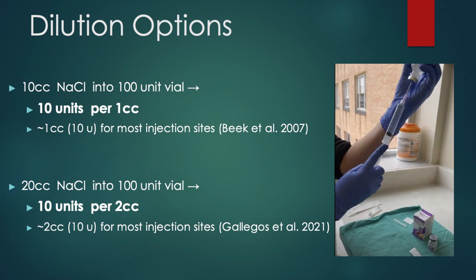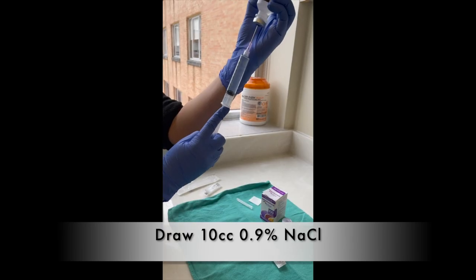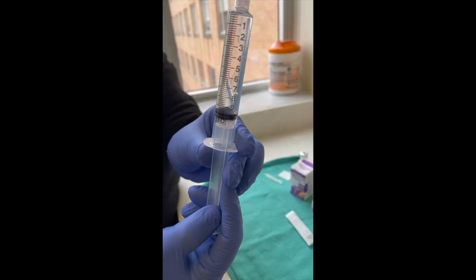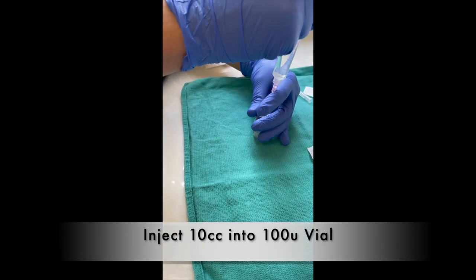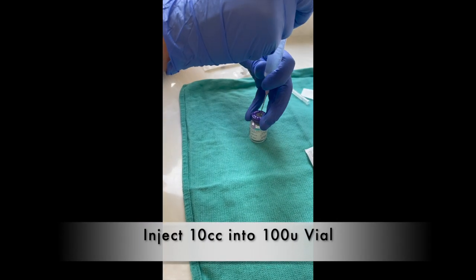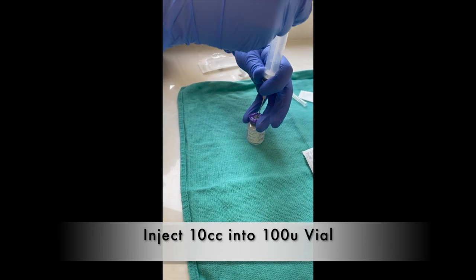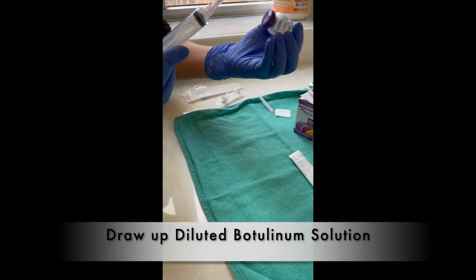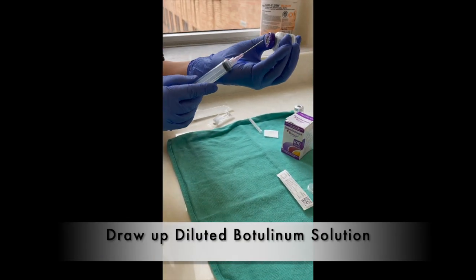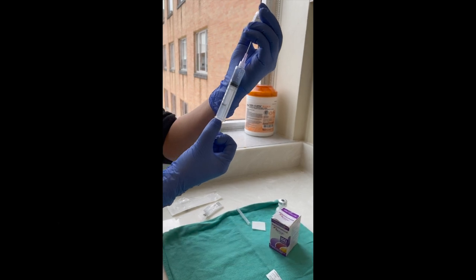This will now be demonstrated. 10 cc's of normal saline are drawn into a 10 cc syringe. This is injected into the 100-unit botulinum vial, creating a concentration of 10 units per cc. The combined solution is then drawn up and ready to be injected.